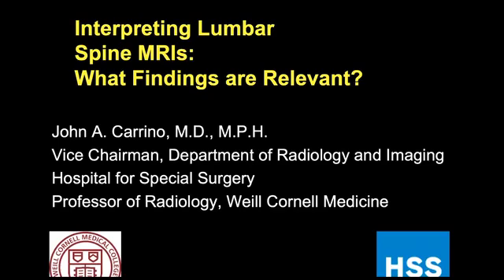And today we're going to talk about a practical topic, interpreting lumbar spine MRIs, and really distilling out what are the features that are relevant that radiologists should be looking for and should be commenting on in their report.